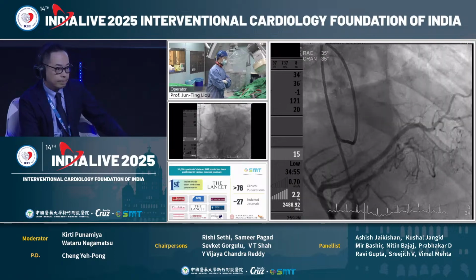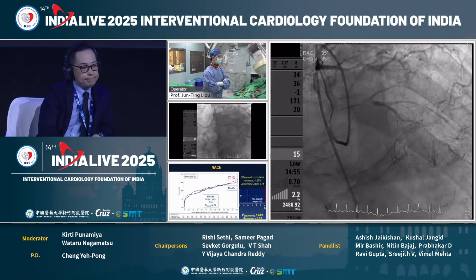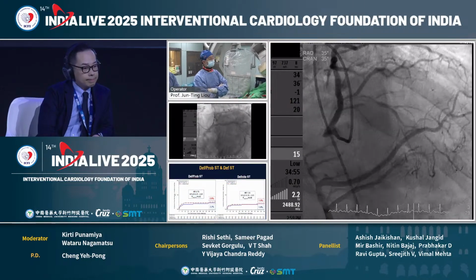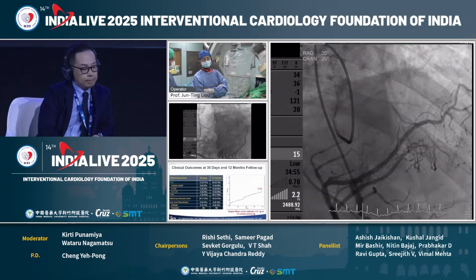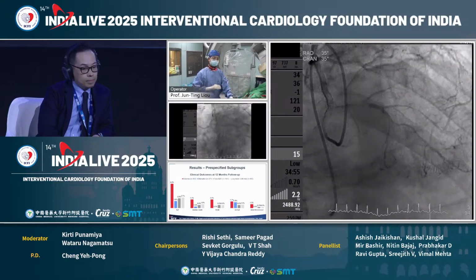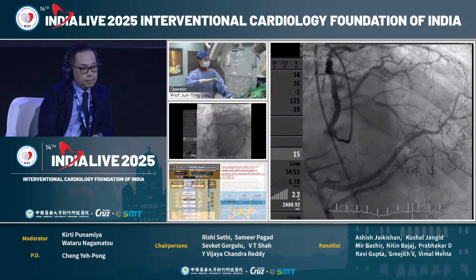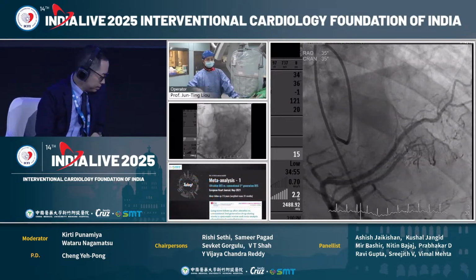Thank you, moderators. I think the difficulty we face today is the CTO. The left main bifurcation issue may not be quite so difficult. As we didn't do a dual injection in the previous procedure, we thought the CTO was straightforward and we could go straight down to the LAD. However, today we face a difficulty because there's a big angulation from the diagonal LAD branch entering the LAD.